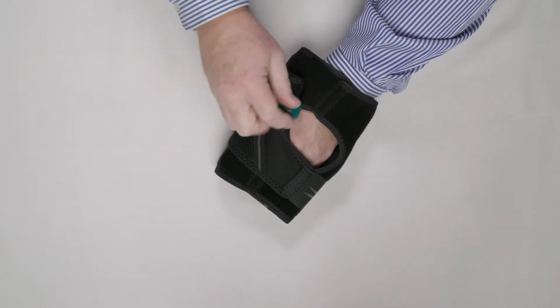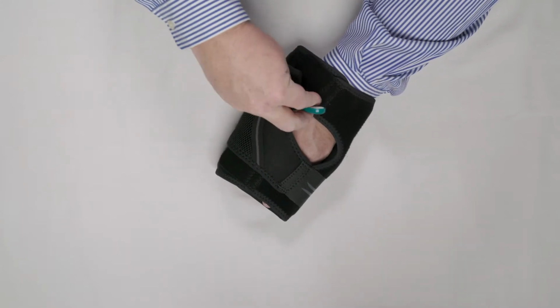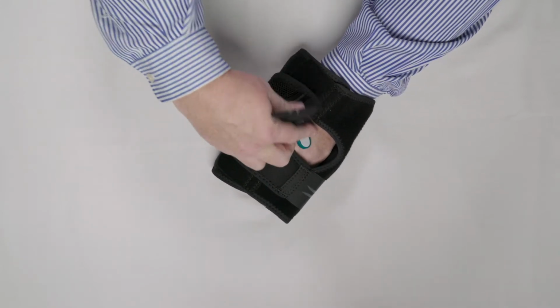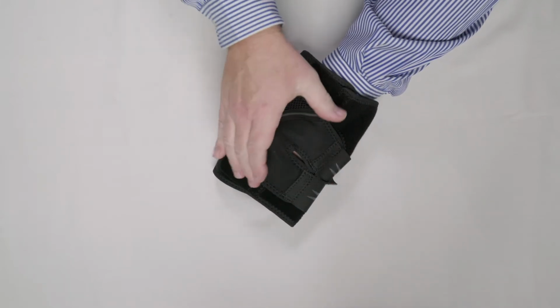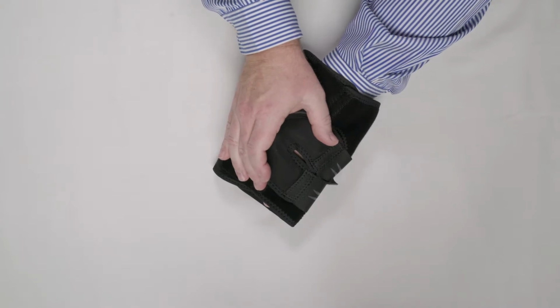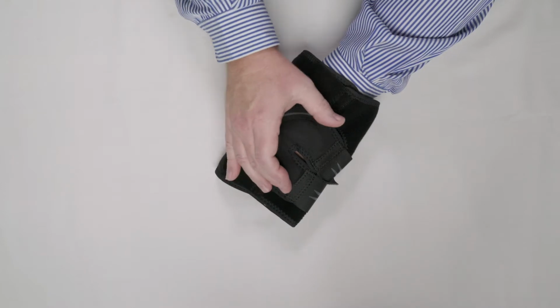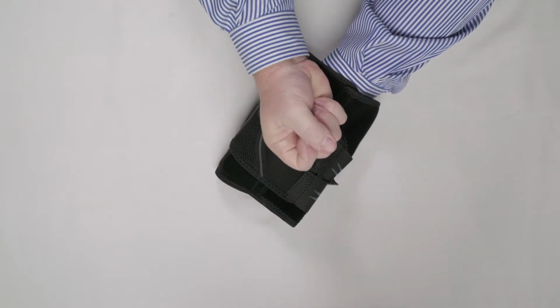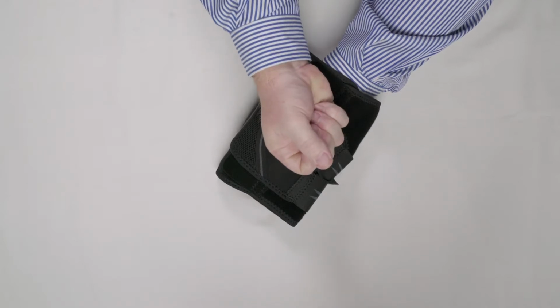Simply taking the leading edge of that buttress and running it over top of the patella and holding it there, we can address anterior-posterior tilt. And by adjusting the tensioning of the straps, we can accommodate rotation of the patella as well. The goal is to dynamically position and hold the patella with full contact right in the trochlear groove, where it is most pain-free for the patient.